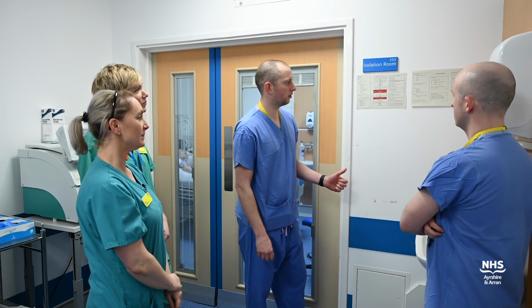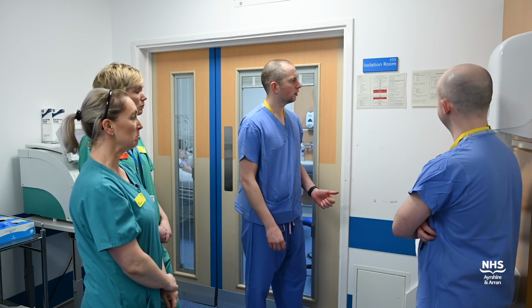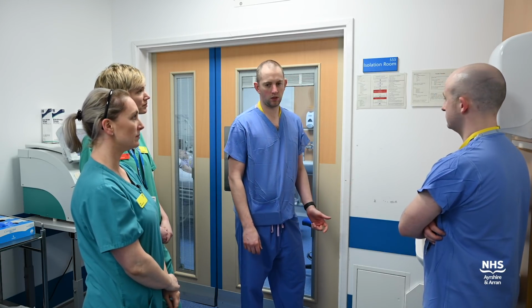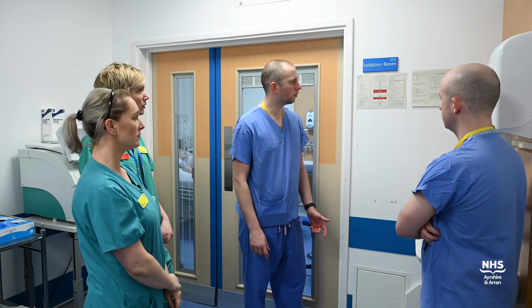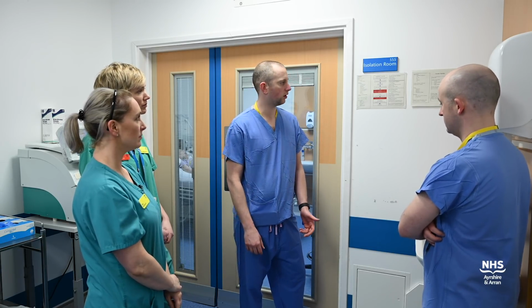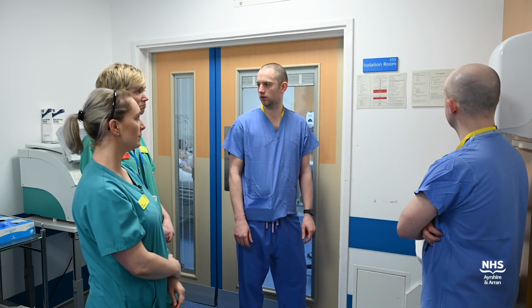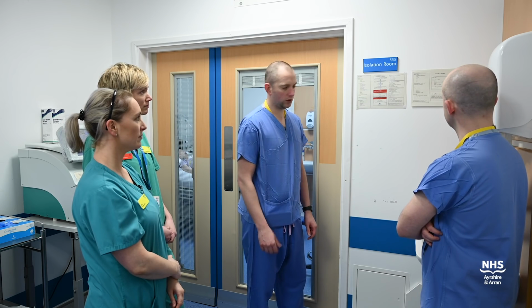Okay, so exit checks. Anyone notice any PPE issues? Yep. Kit issues and decontamination? Don't think we have any problems, did we? Intubation sticker will put in the notes, chest x-ray will order. Any points to debrief or any learning issues? Great, we'll restock the trolley.